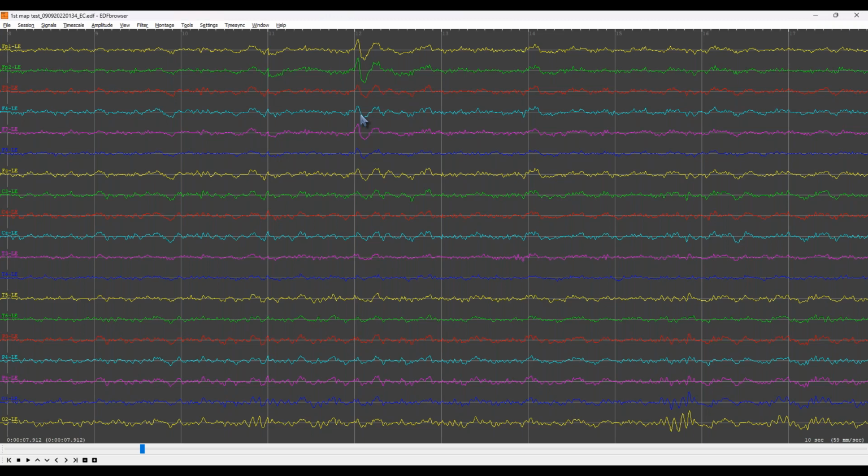So if we kept seeing signals like this in a playback, we know it's something they're doing. Either they're emoting to maybe a movie that we shouldn't have let them watch to begin with. Action scene, they get really surprised, eyes open wide type of thing. Or maybe you've got a client that just has dry eyes. You've got a client that's got a pair of contacts that should have been changed out 2 months ago.